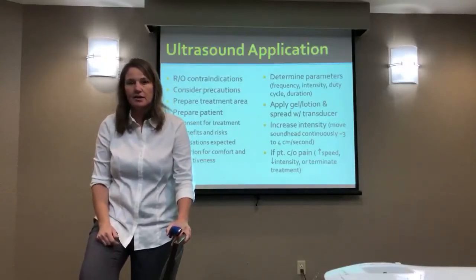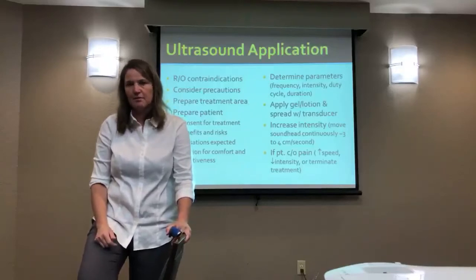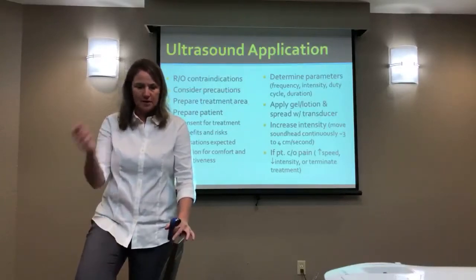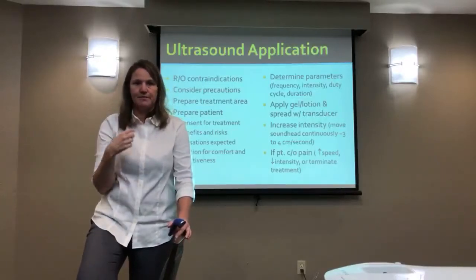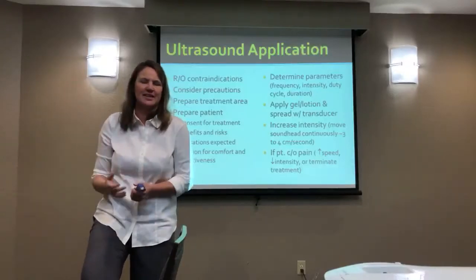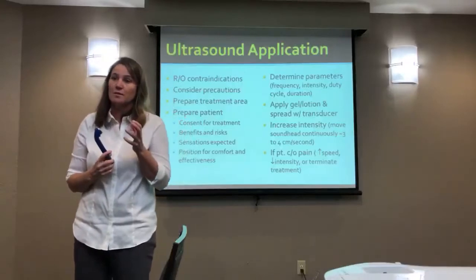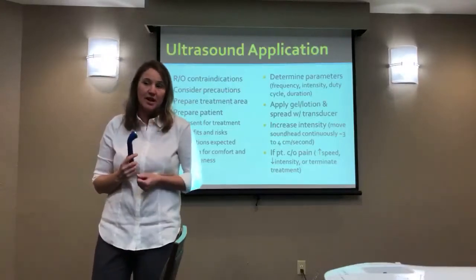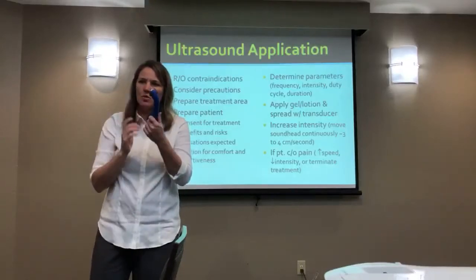Depending on where you're treating, I am much more concerned about my vulnerable patient, that I'm going to put something on them or expose them, than I am worried about somebody's shoulder who has intact skin. But yeah, absolutely, I would make sure it's clean. And also, whether a sanitizing wipe is enough is a question that I would have. Like, this particular head, wiping it with just a wipe is not enough.